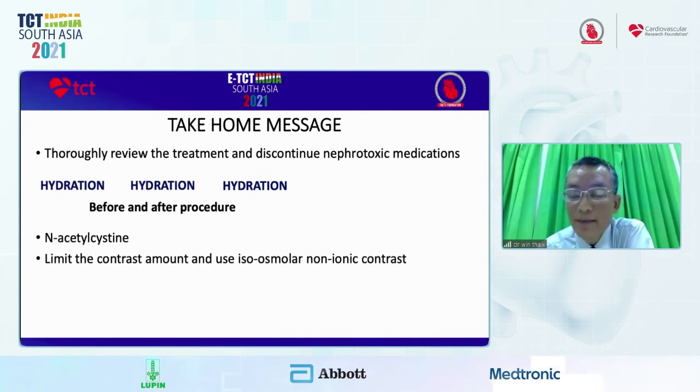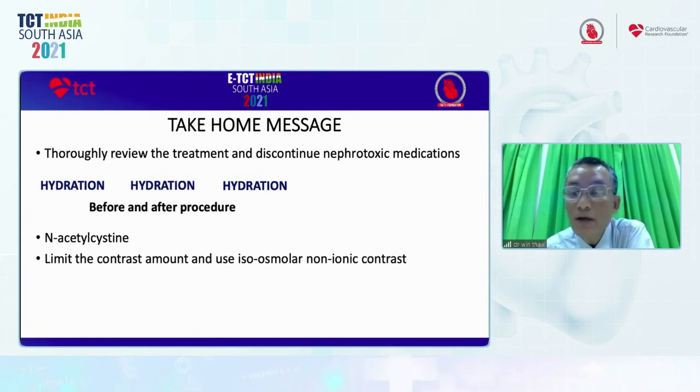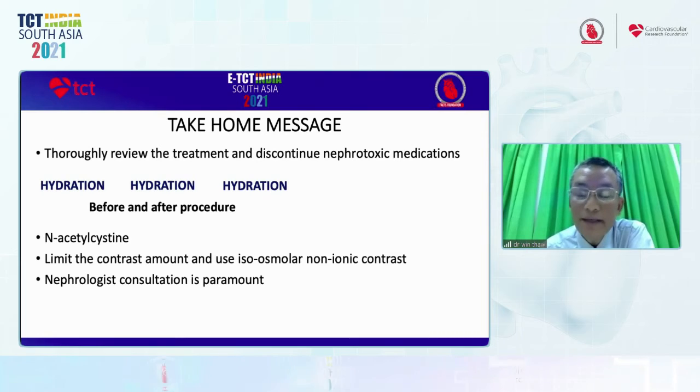Although the amount of contrast in my cases was 150 to 200, we need to limit the contrast amount. And if possible, we need to use isoosmolar non-ionic contrast. Last but not least, I want to suggest that nephrologist consultation is paramount in the management of PCI in the CKD patient. Again, my cases are simple, a bit straightforward.